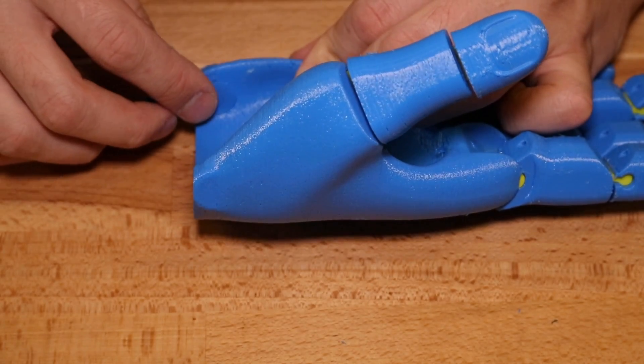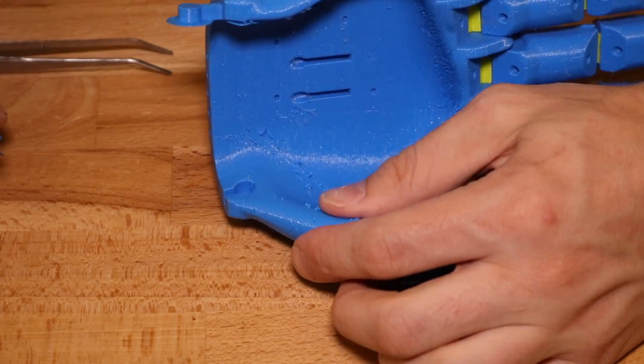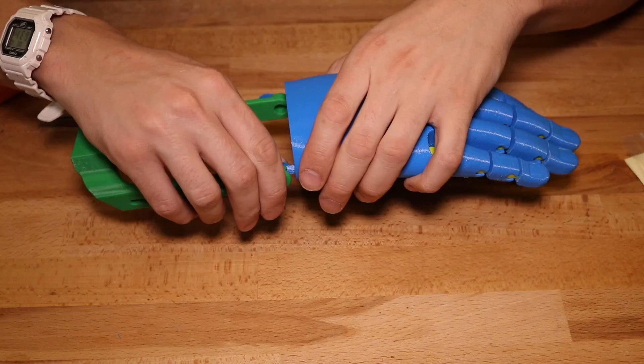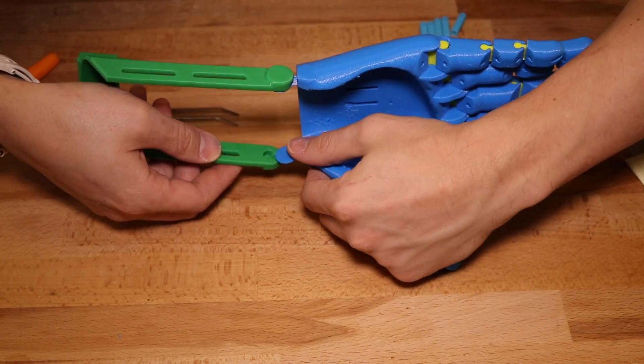To attach the gauntlet, press the hinges into the palm and make sure there's a firm connection between the two. You can also put a little bit of CA glue in if you want a firm connection. Once attached, place the opposite end of the hinge into the gauntlet.